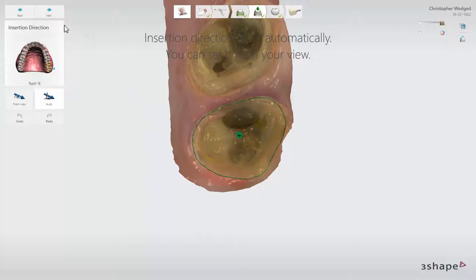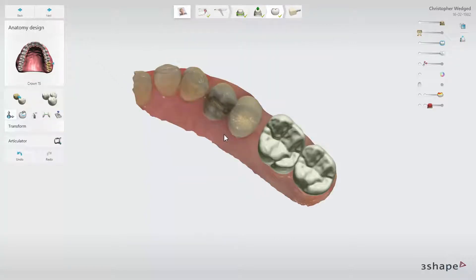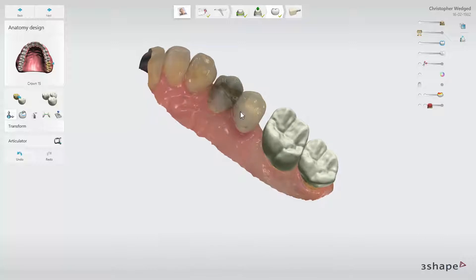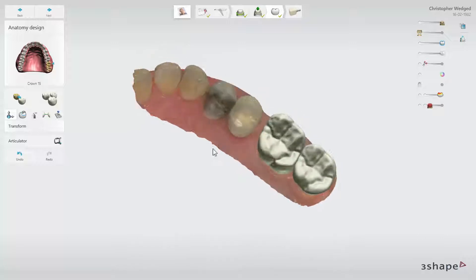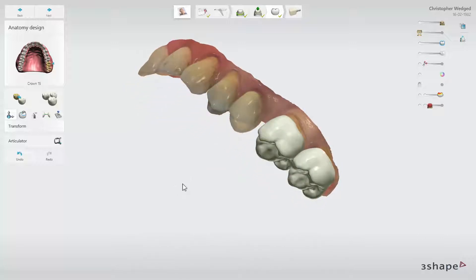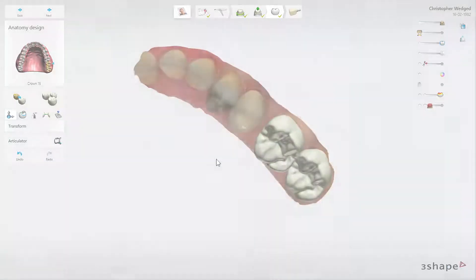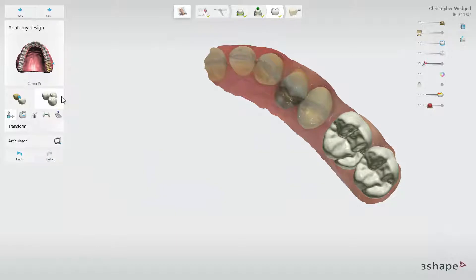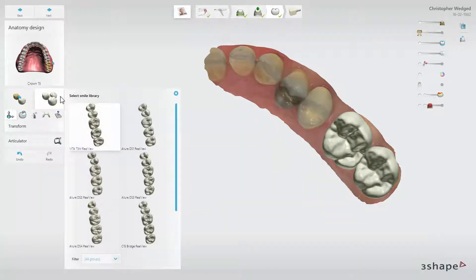Click Next to move on to the Anatomy design step. The software automatically generates valid designs for both restorations. You can select different available teeth designs from the Smile Library selector — simply click on the one you prefer and the software will create a valid design.